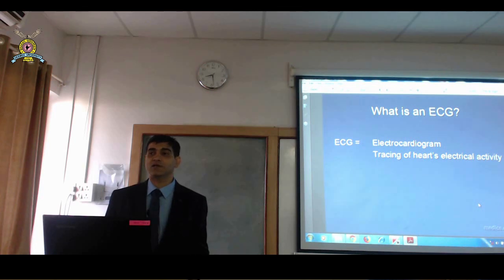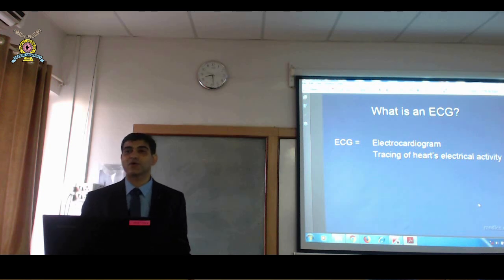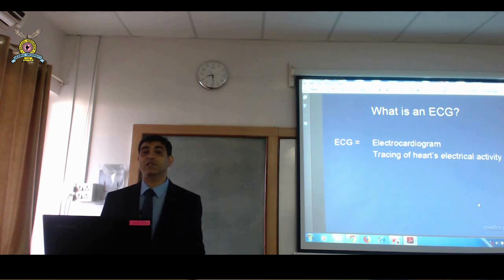Sometimes you get a patient with a heart attack and the ECG is normal, right? But then don't discard them away. You have to repeat the ECGs until you find it. So you have to always see the ECG in clinical context. This is an important statement. ECG is never seen alone. ECG has to be seen in clinical context. What is the patient like?